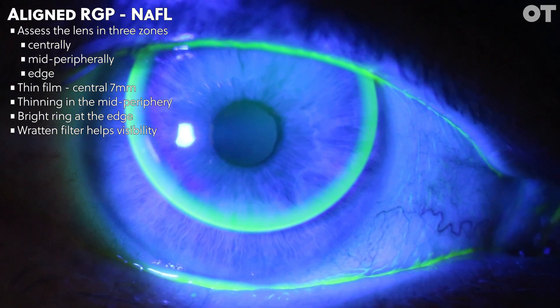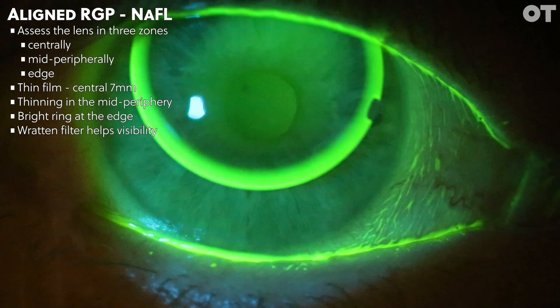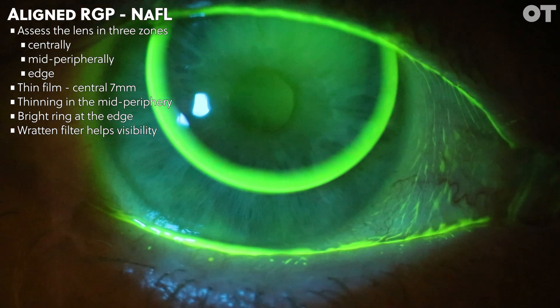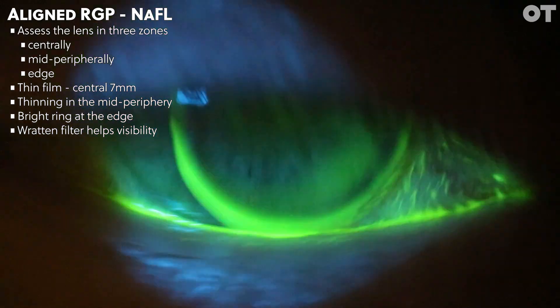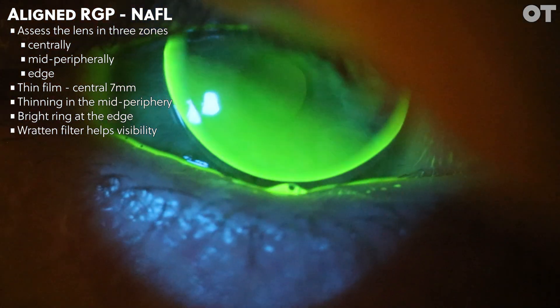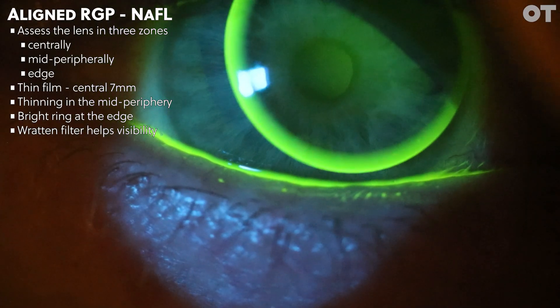In this video, you can see the fitting is far easier discerned using a Rattan filter, which blocks out the reflected blue light to enhance the fluorescein pattern. The fitting of the lens shown here could be improved by reducing the edge lift, as the edge clearance is allowing bubbles to get under the lens post-blink. This can be rectified with the manufacturer by asking for a reduced edge lift.